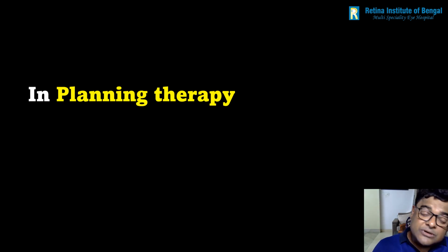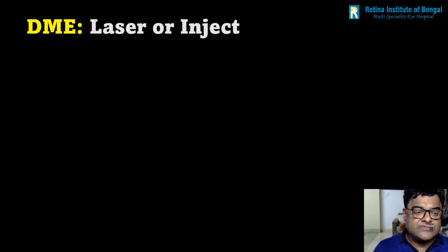Second, it is important in planning treatment. Now, OCT is very crucial in planning treatment in cases like epiretinal membrane, macular hole, wet AMD. But I will just explain how we apply knowledge gained from OCT in managing DME patients, because diabetic macular edema is probably one of the commonest medical retina conditions we all face day to day.